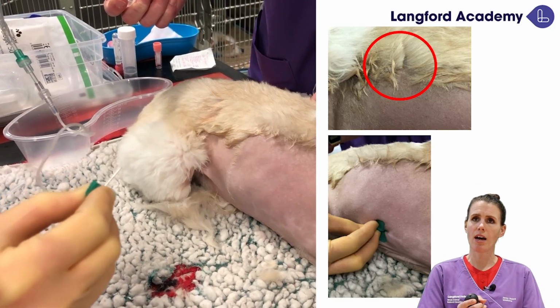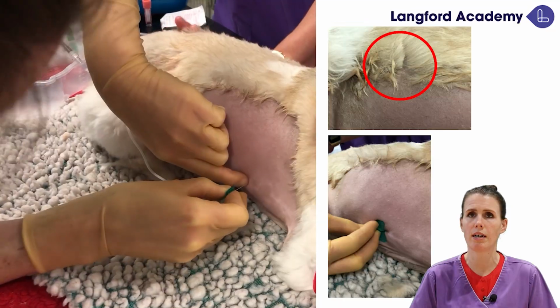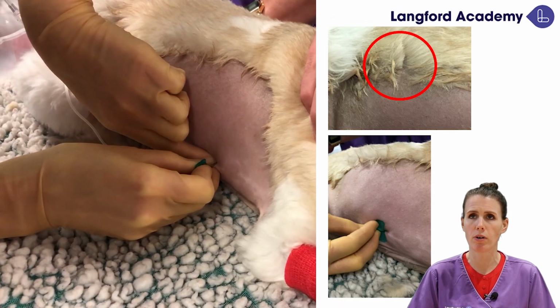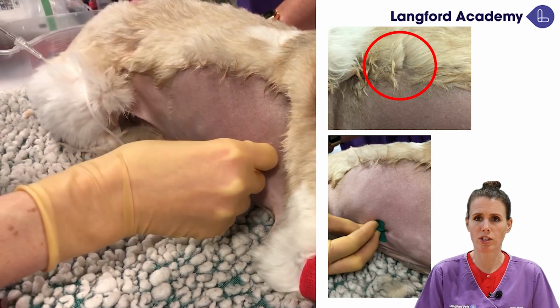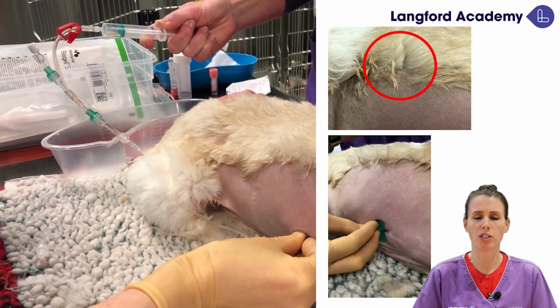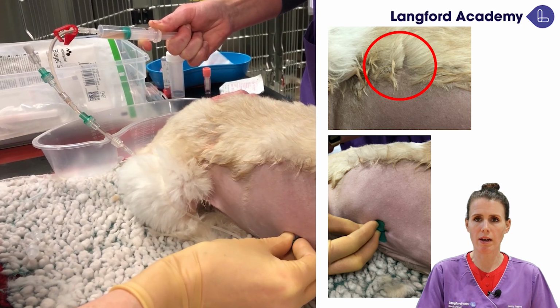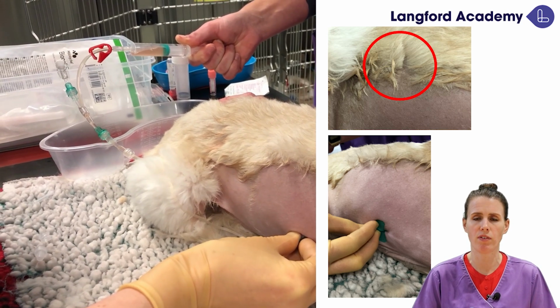And you can either have your colleague count the rib spaces for you and point it out as we did in this video, or alternatively, in the picture at the top right of this slide, we've clipped a notch in this patient's fur at the 7th to the 9th rib, which is a visual aid that enables us to see exactly where that landmark is without the person who's doing the thoracentesis touching outside of the sterile field.